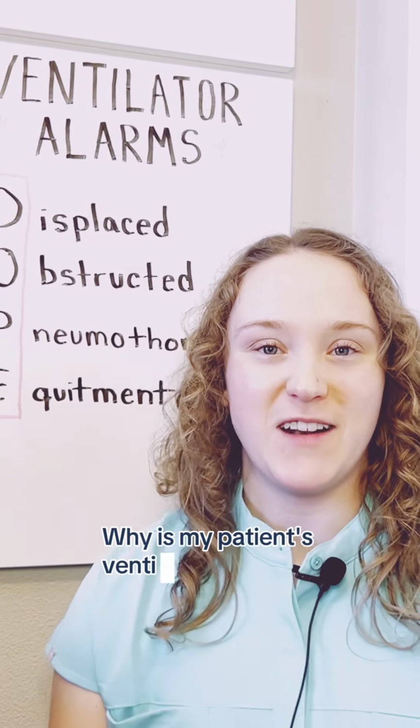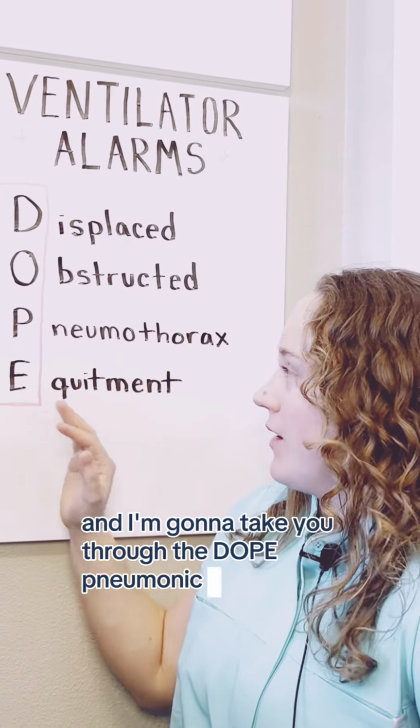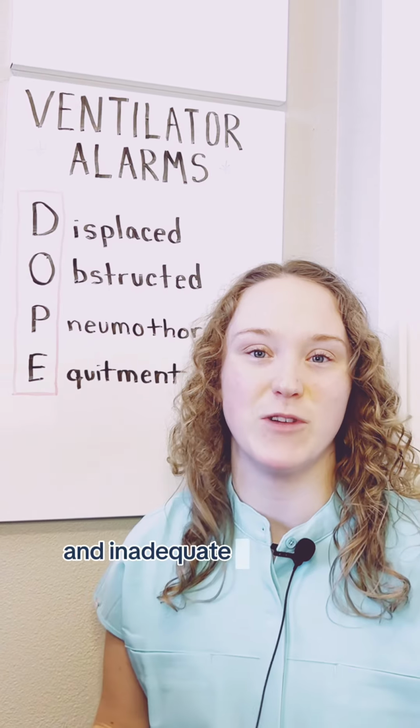Why is my patient's ventilator alarming? My name is Kaylee, I'm an ICU nurse, and I'm going to take you through the DOPE mnemonic today, and this is something you can use to help troubleshoot ventilator alarms and inadequate ventilation.